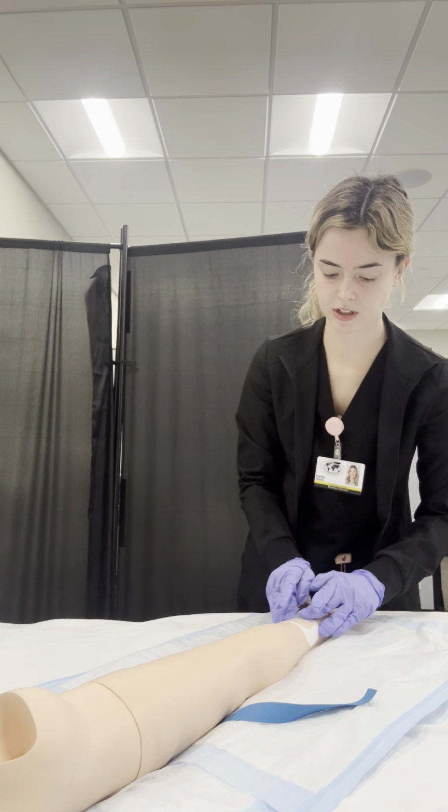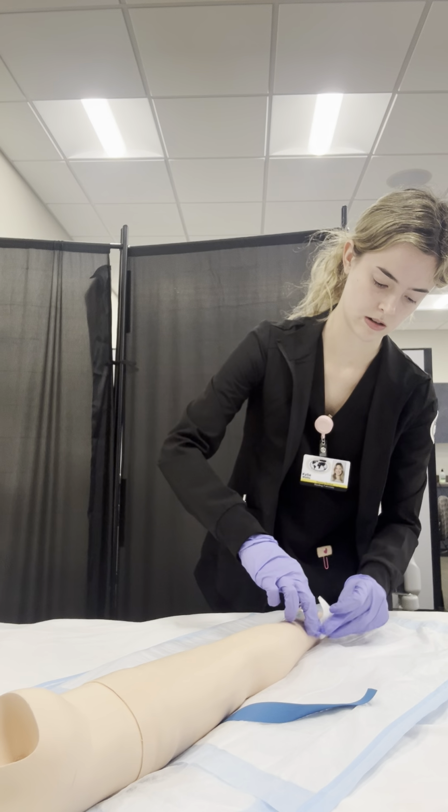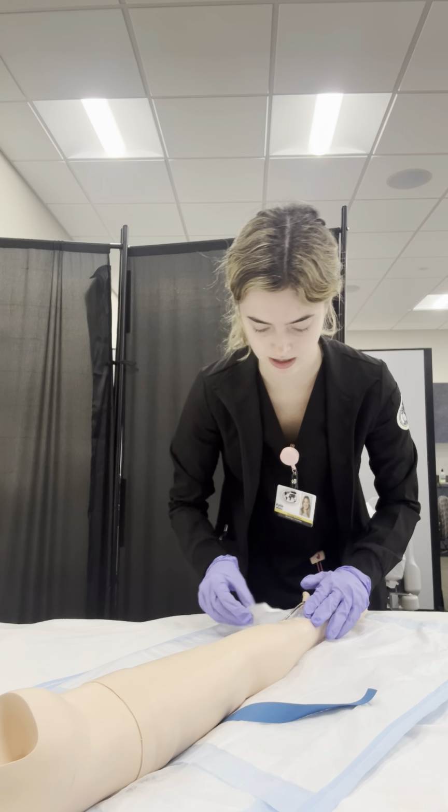Okay, so that is firmly secured. So I'm going to peel this off around it.